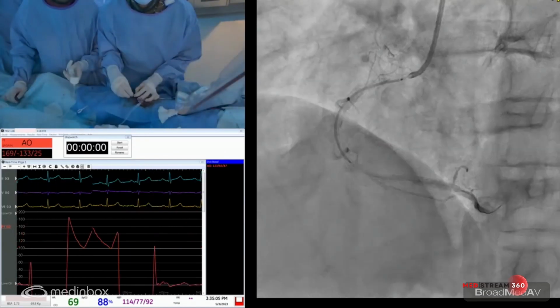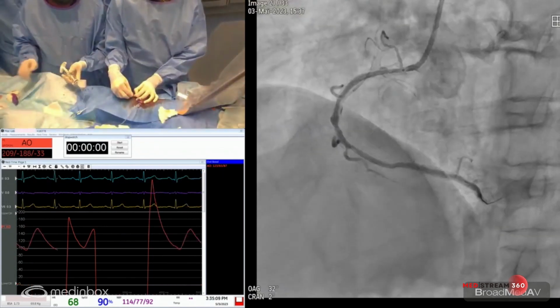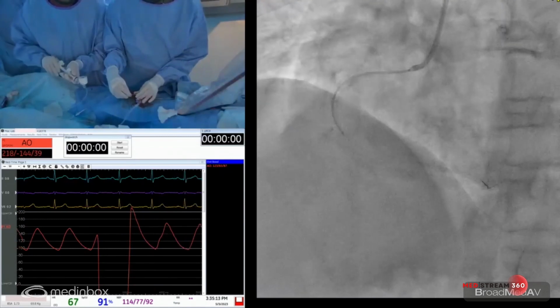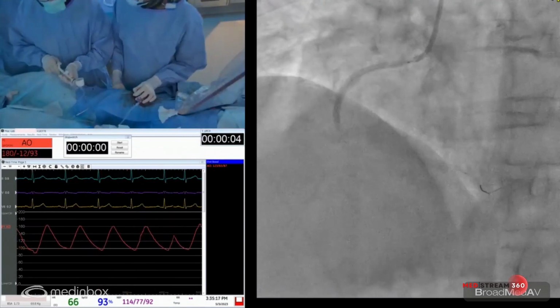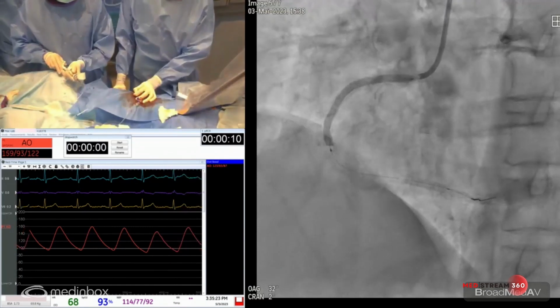Okay, everyone, I think we're covering everything. Laurel? Yep. You might want to pull back a bit. Yeah. Okay. On. I'm going 275. We're going to take this to 18 at least because we know it's a 3.25 vessel. So the stent outer diameter now is at 3.22 millimeters.